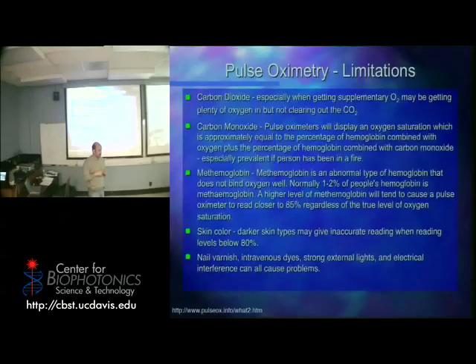It doesn't use this little inexpensive throwaway piece, but a fiber optic that goes in and measures all those different wavelengths. The way you discern more species in your blood is you find more points of absorbance to check and look at those ratios. They are now sophisticated enough to look at 6 to 8 different wavelengths and distinguish methemoglobin versus carbon monoxide poisoning versus actual oxygen saturation in hemoglobin. Okay, good question.